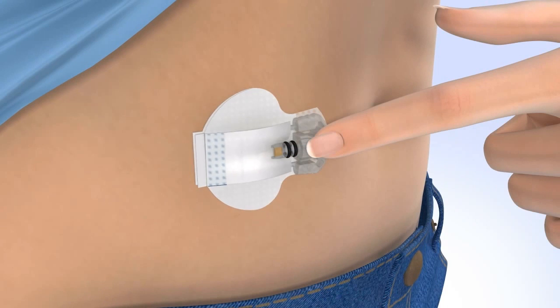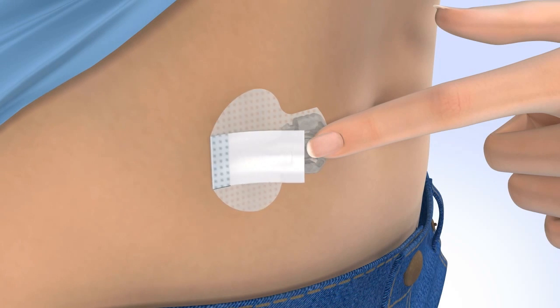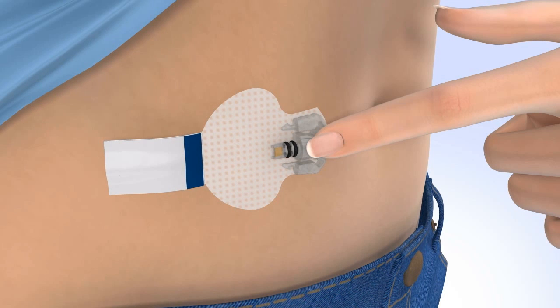Carefully remove the adhesive liner that is located underneath the curved adhesive pad. Press the adhesive against the skin. Now flip the adhesive tab so that it lies flat against the skin, but do not remove the adhesive liner just yet.